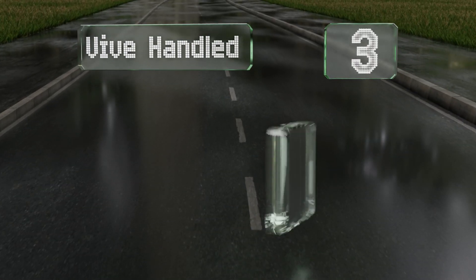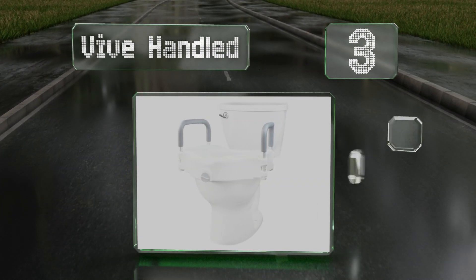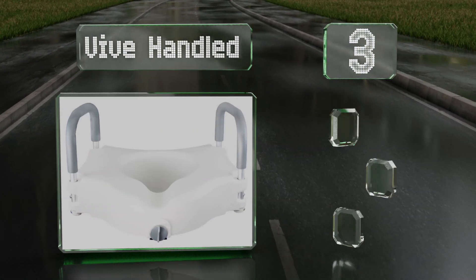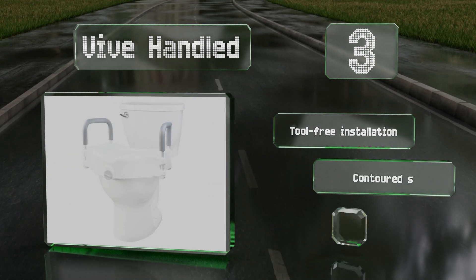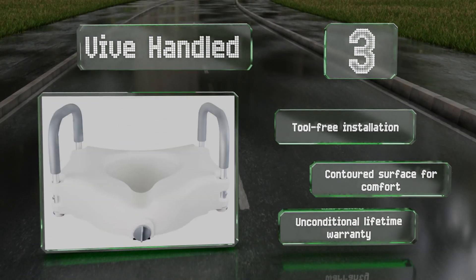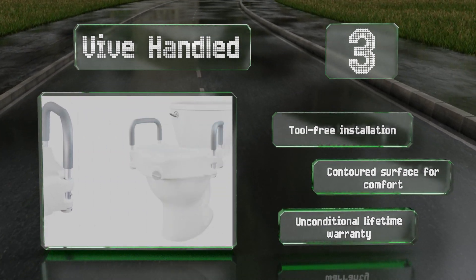Nearing the top of our list at number 3. At 5 inches tall, the Vive Handled is an effective solution that offers a lot of lift. It features a clamping lock mechanism that tightens easily with one hand to hold it securely in place and has a deep front recess for better hygiene. It boasts a tool-free installation, a contoured surface for comfort, and an unconditional lifetime warranty.